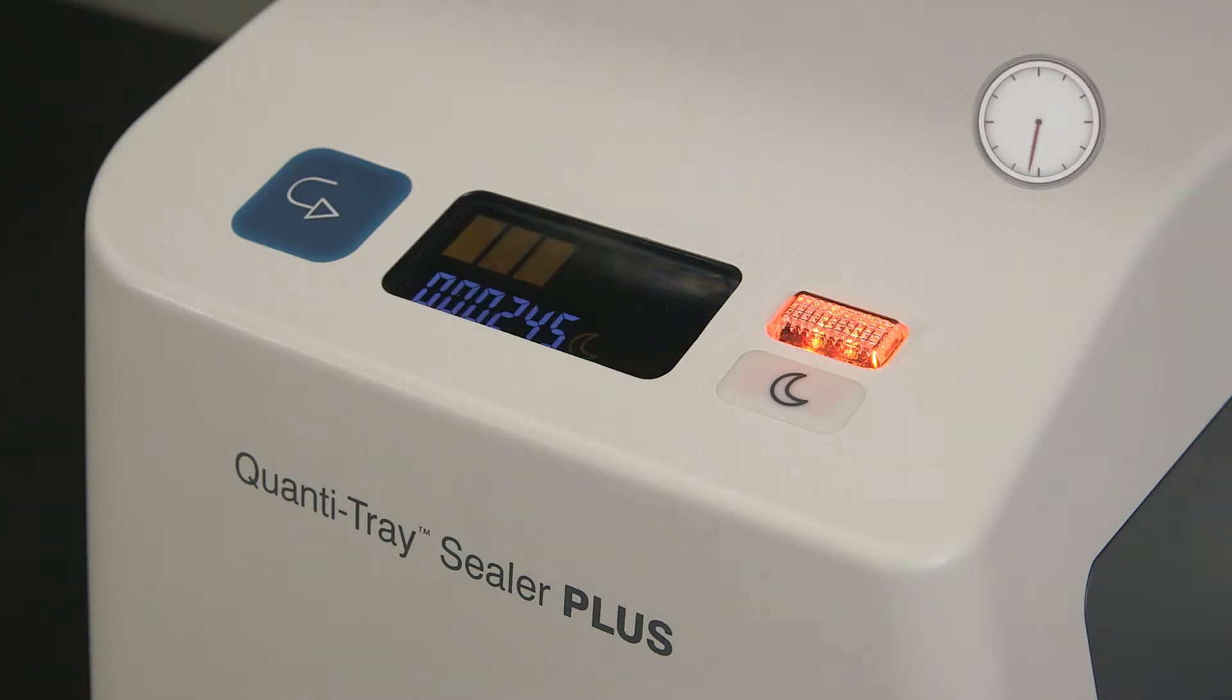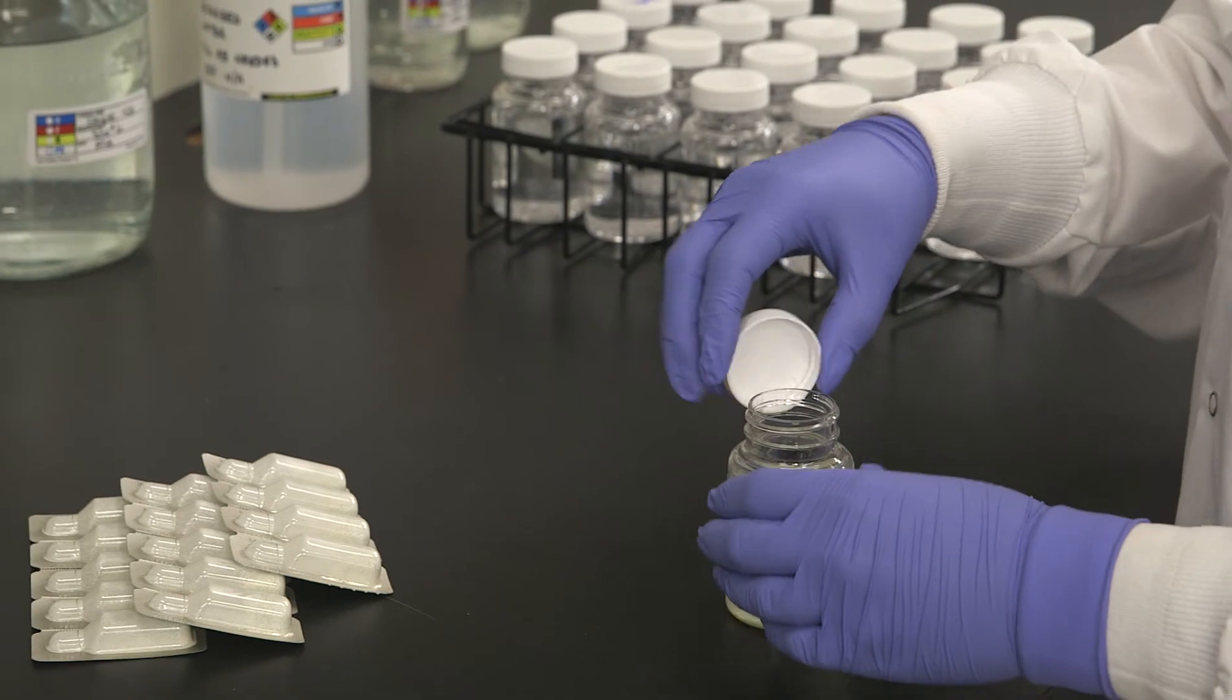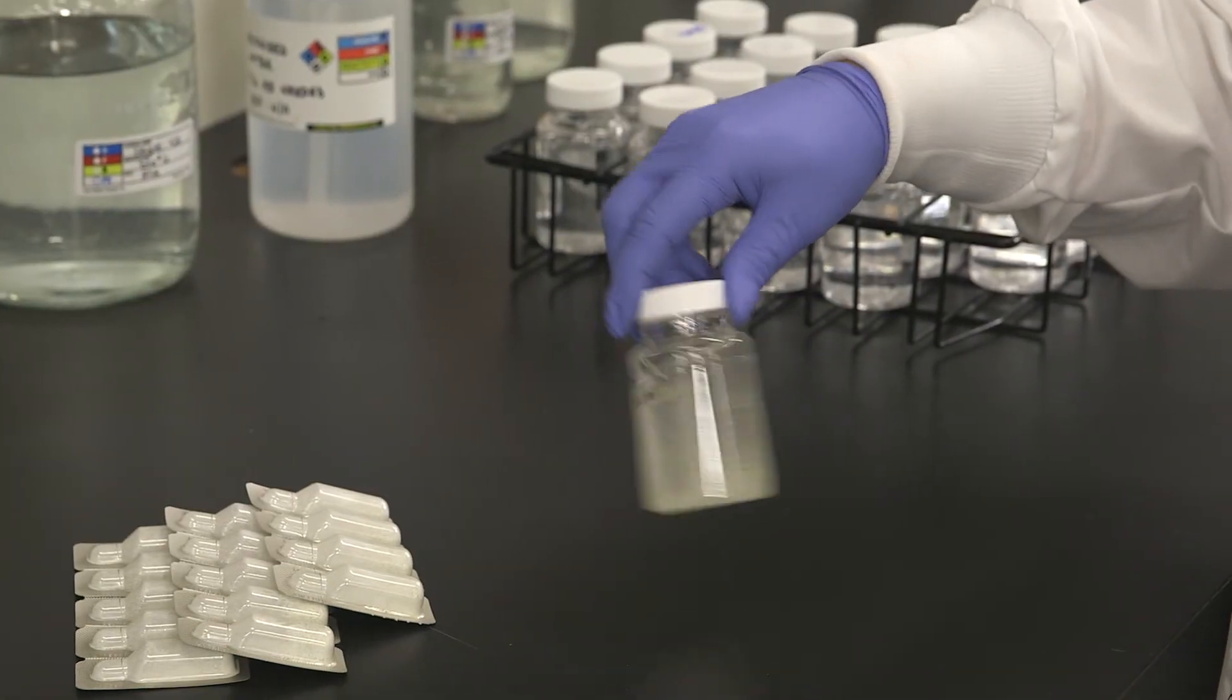Turn on the sealer and then wait until a green bar appears on the display. The sealer has now reached operating temperature. Add the ColiLert powder to a 100ml sample and cap the vessel. Shake until the reagent dissolves.